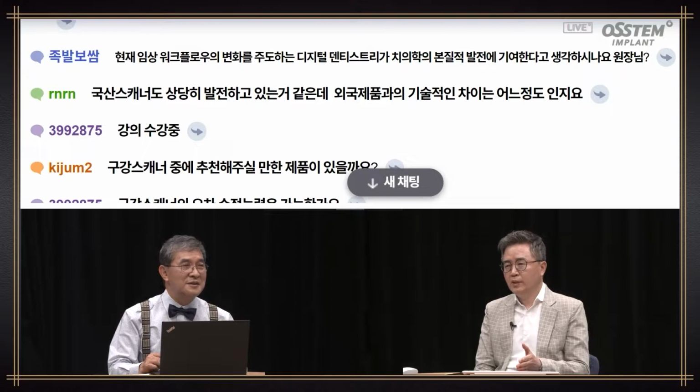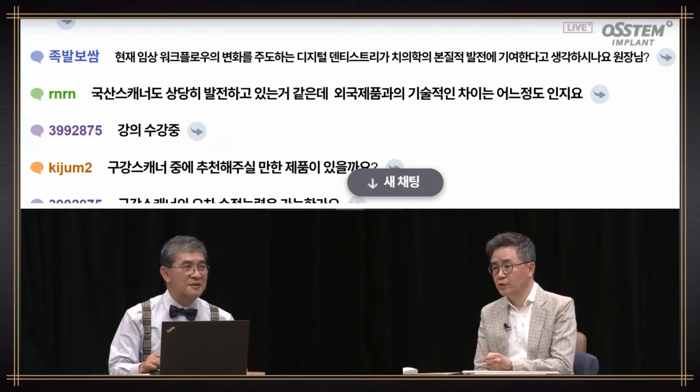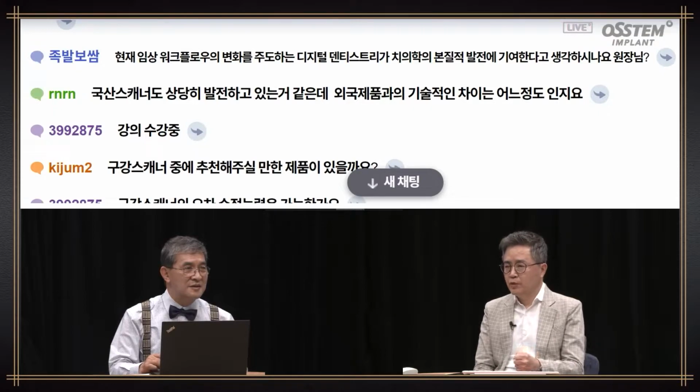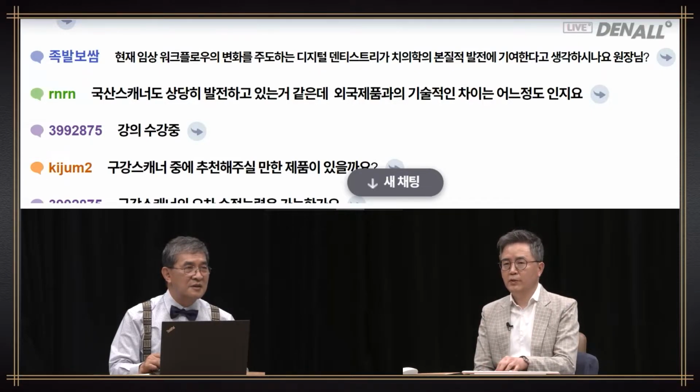In the CAD/CAM dentistry phase, this is limited to manufacturing design. In the past, you took an impression and milled it and cast it. Now it's changed to milling and printing. But it's still dependent on the experience and knowledge of the person who is doing it. Yes, in terms of workflow process, digital transformation has occurred. Professor Lee from SNU's lecture really touched my heart because the professor said there have been changes in technology. However, it does not mean changes in science.